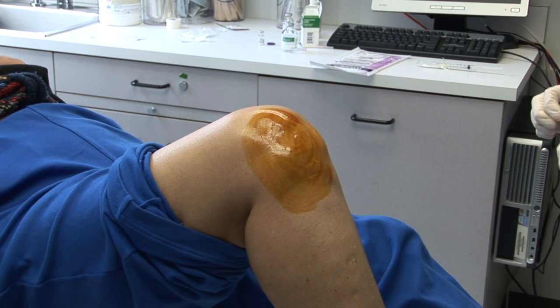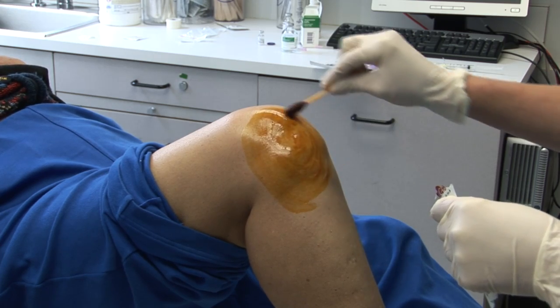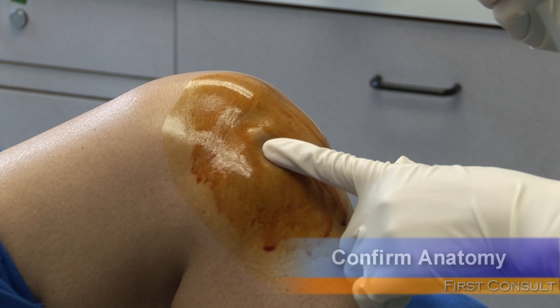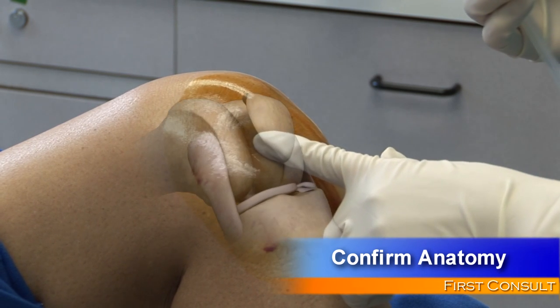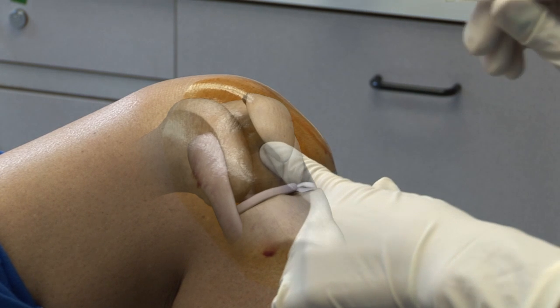To perform the injection with the inferior lateral approach, place the patient in the supine position with the knee flexed to 90 degrees of flexion. Carefully palpate the knee to identify the anatomic landmarks, which are the patella, the tibial plateau, and the patellar tendon.